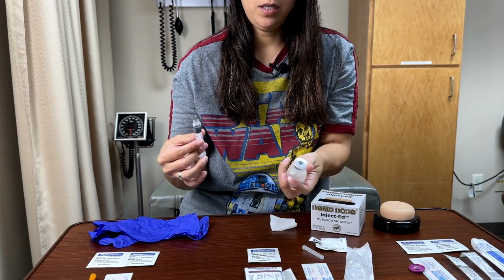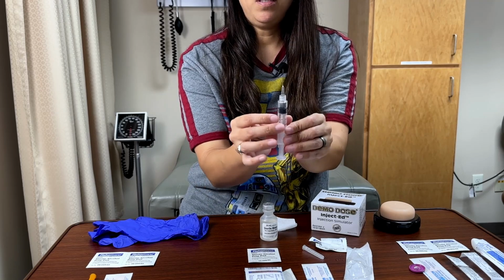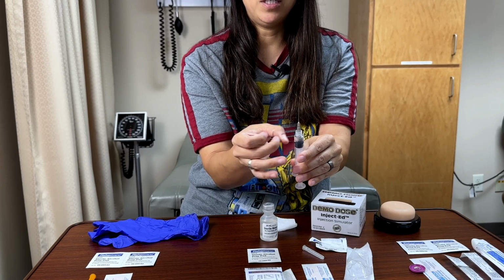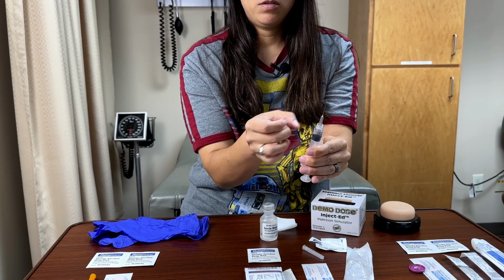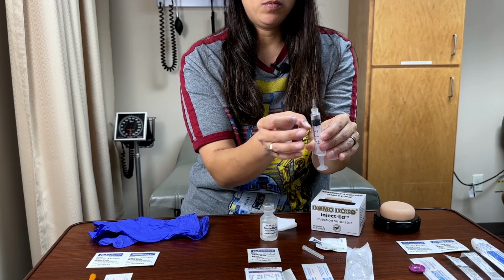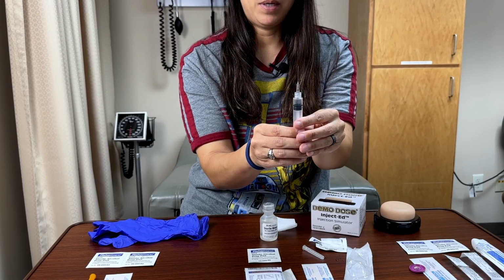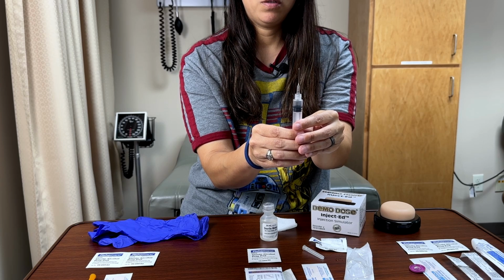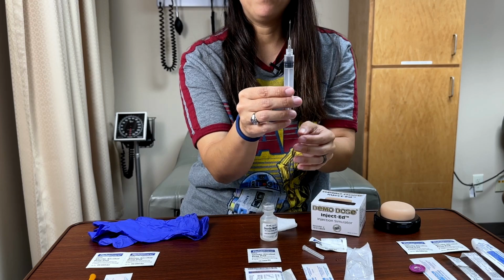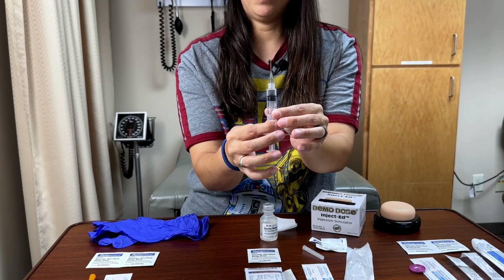Once I have the medication that I needed, I'll withdraw my syringe. Then you'll see that there are some little air bubbles in here, so we want to get rid of those. We'll gently tap the syringe to get the air bubbles up, and they will coalesce here at the hub of the needle, and then we can gently get them out. So I'll gently push until I see that the air bubble has traveled up and out of the needle. And then it's prepped. I have my 1 cc prepped and ready to go.